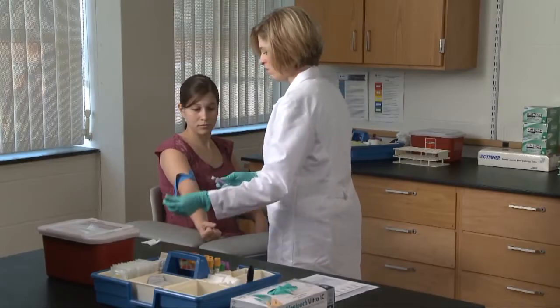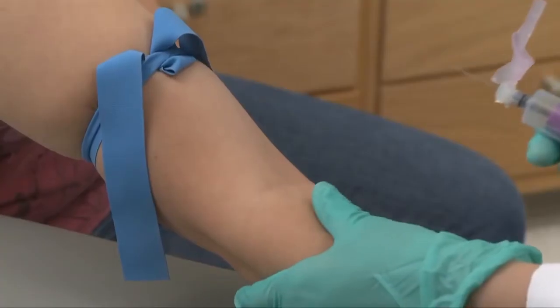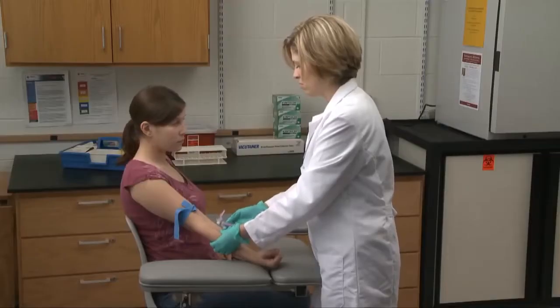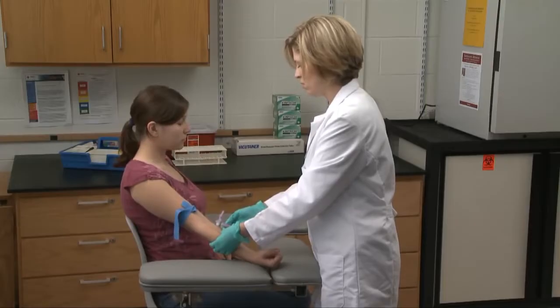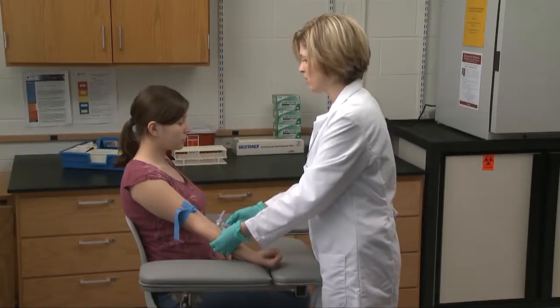Grasp the patient's arm firmly with your hand, placing your thumb approximately 2 inches below the intended puncture site. With your thumb, pull the skin taut over the vein to help anchor it in place. Then let the patient know you're ready to make the puncture so the patient won't startle and jump. You'll feel a slight pinch.